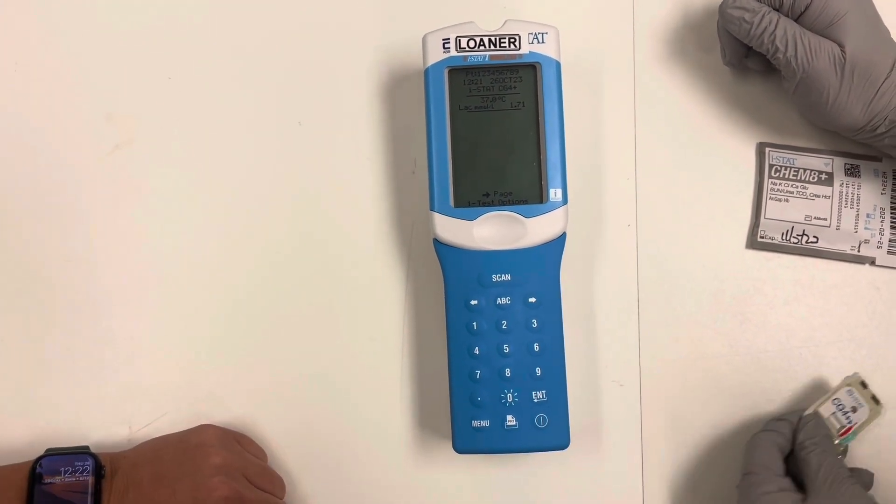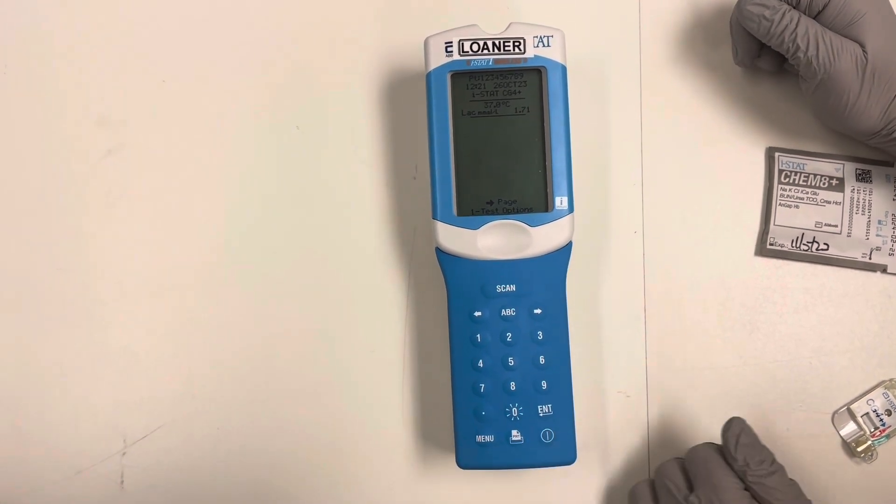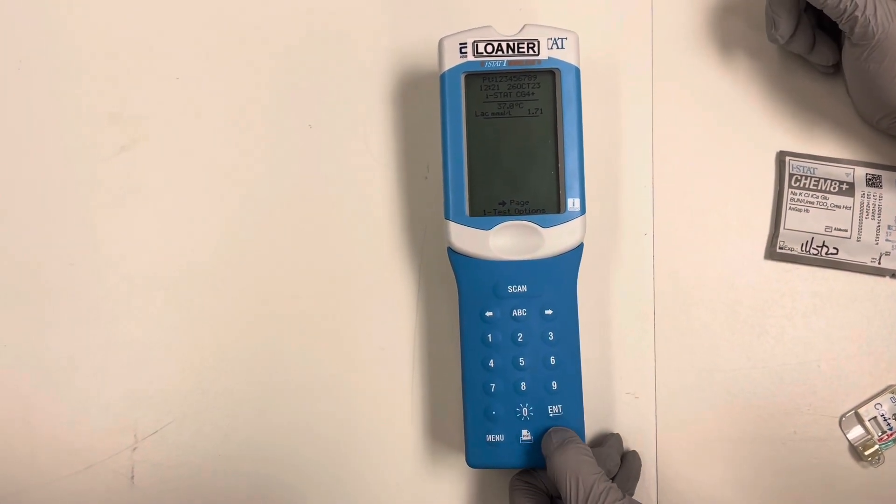So you are done with your test. You can remove the test card and you can power it off. When you power it off, that's what sends it to the electronic health record.